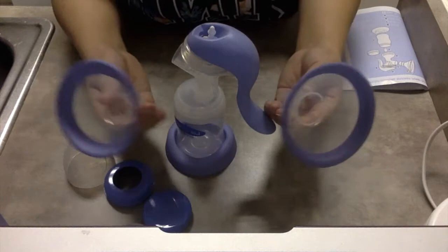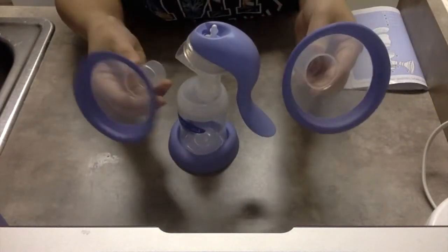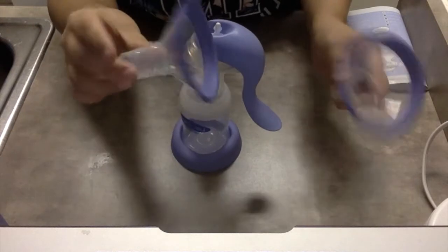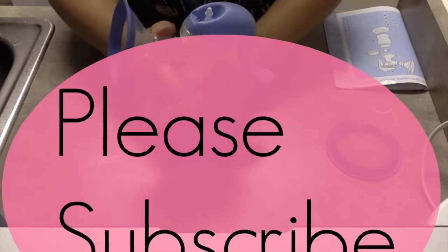And then whatever flange is the best size for you, try them out. But this is the one I use, the smaller one. So this just goes right here. And that's your assembly.